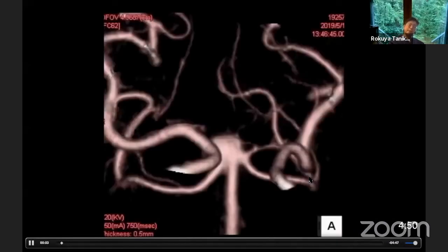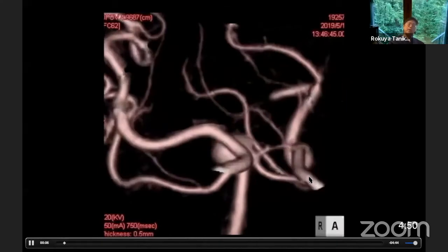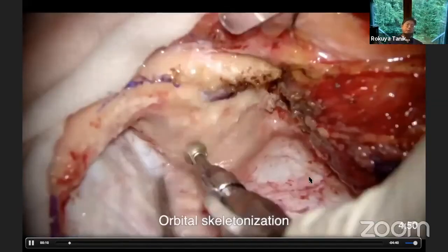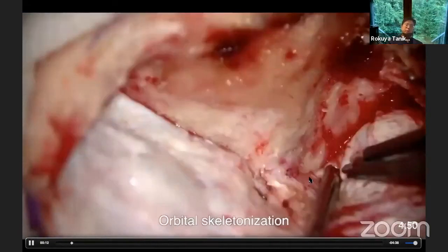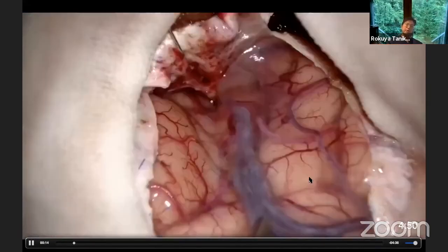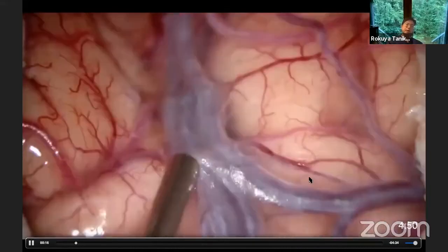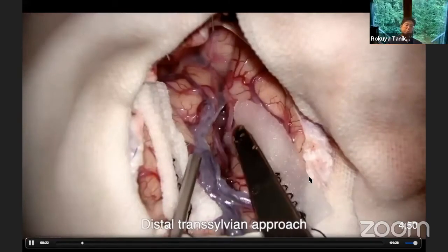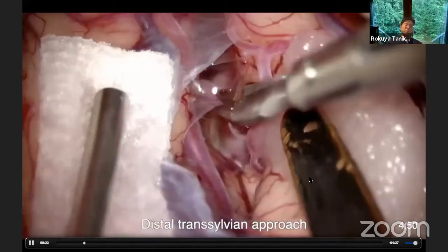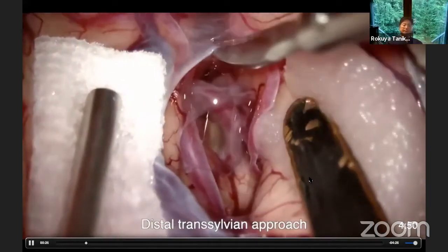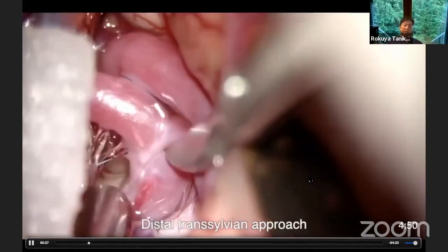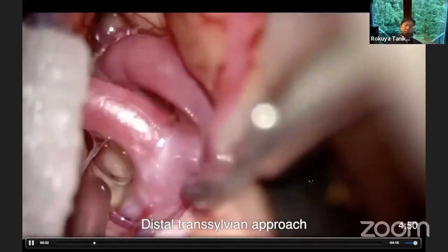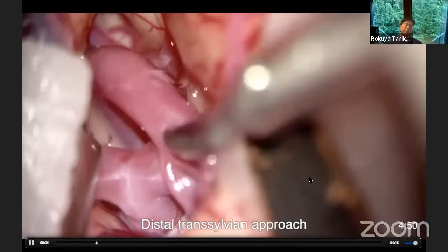The next case is a 77-year-old female with a right-side basilar-SCA aneurysm. The right P1 is very hypoplastic. This is the right frontotemporal craniotomy with sylvian fissure dissection. I opened the dura and am trying to split the sylvian fissure from distal to proximal. Now I am exposing the MCA bifurcation and the M1 segment, then approaching the carotid system.